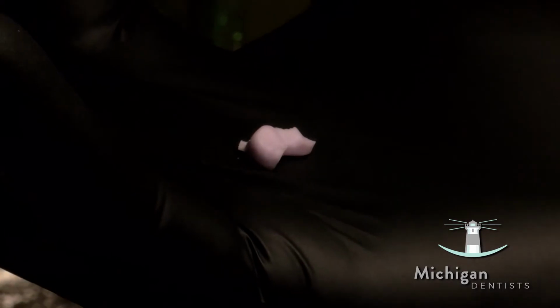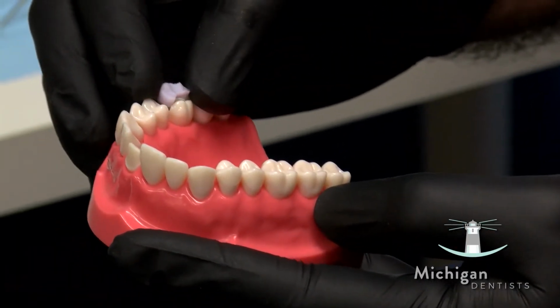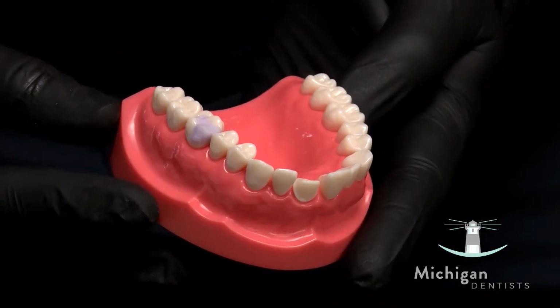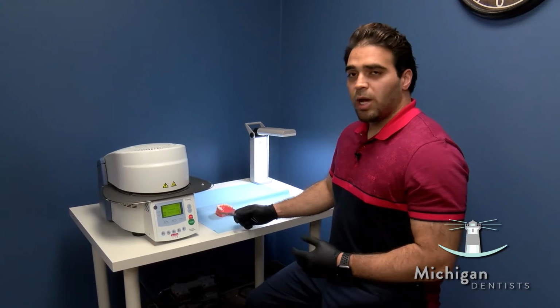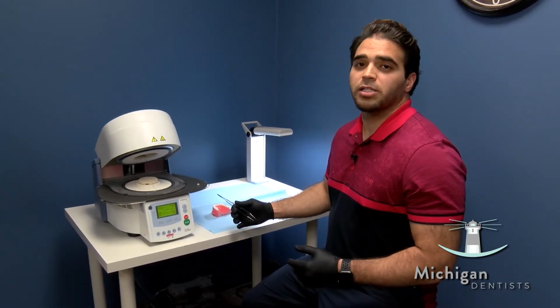So now that the mill has finished cutting our crown, I usually try it in the patient's mouth to make sure it's just right. So now it's time to put our crown in the oven where it doubles in strength and changes to our custom shade.